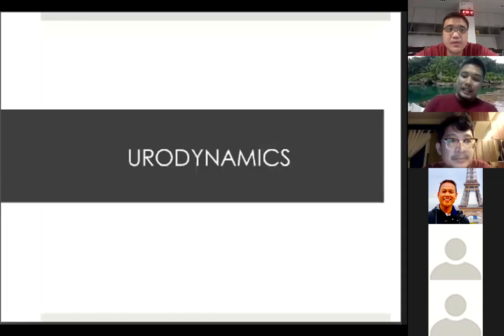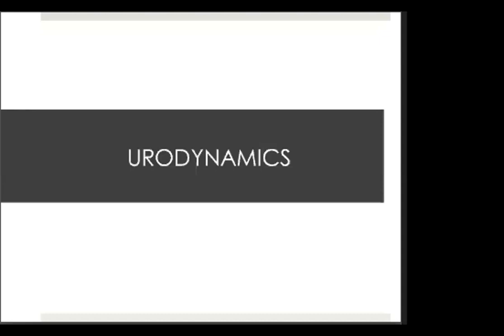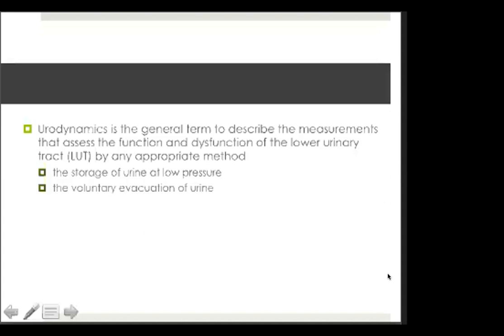Okay, so for tonight, we're going to discuss urodynamics. So urodynamics is the general term to describe the measurements that assess the function and dysfunction of the lower urinary tract.